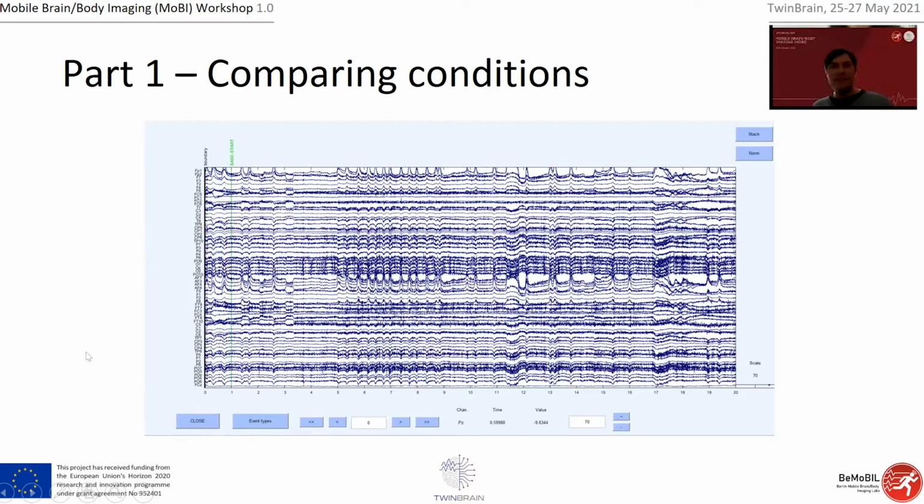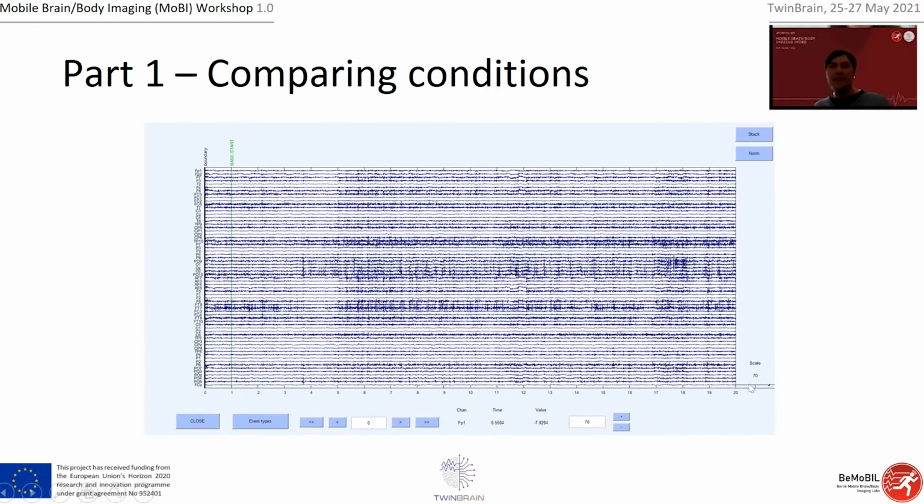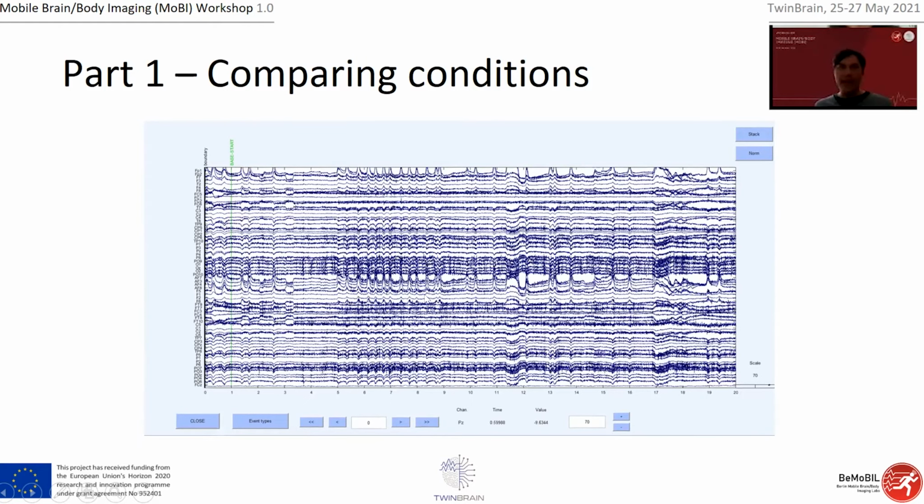And when selecting these components, as I did, we can try to get rid of those. This is exactly the same scale, same data, same time range. And if you go back and forth, you can already see that the ICA correction did a good job. It's not perfect data because there's still some noise in it, but it's way better. Just compare the former to the latter.